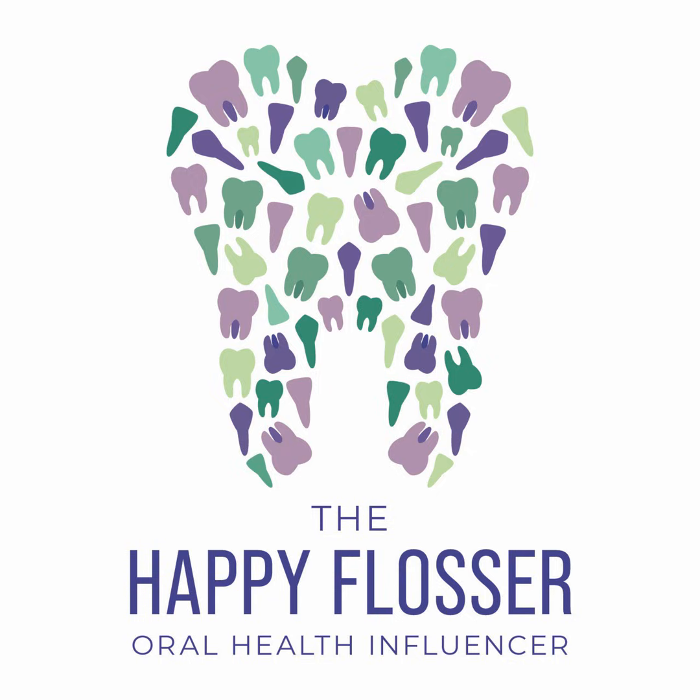Definitely identification of all the different dental materials. They show up differently on the radiograph, either radiopaque or radiolucent. So you want to make sure that you're not thinking something is a dental material when in fact it could be decay. So make sure you're always cross-referencing your findings on the radiographs with the clinical presence in the mouth and what your patient presents with.